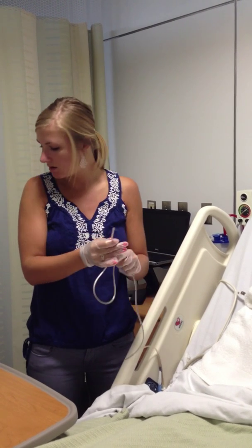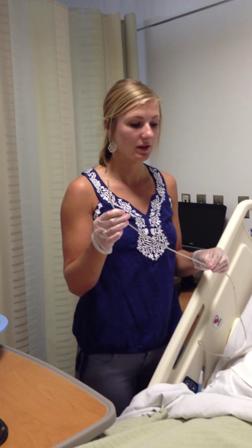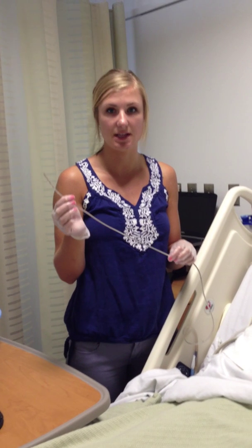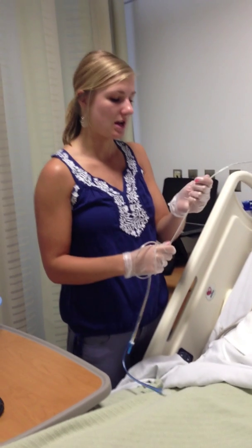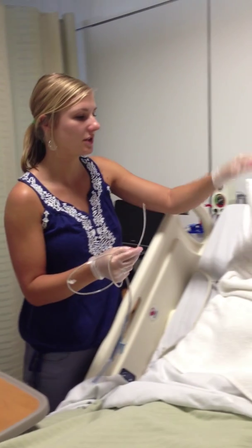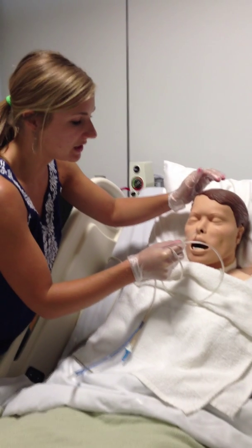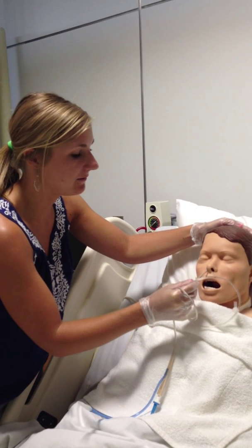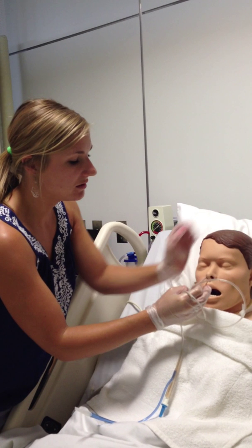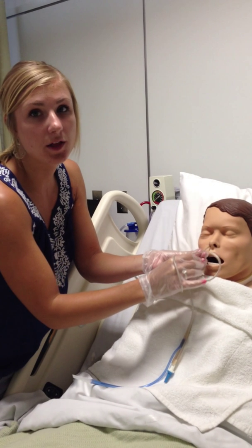I'm going to give our patient a cup of water, which will help during insertion. I'd also lubricate four to five inches of the tip of the tubing to help the process go in a little bit smoother. To start, I'm going to have the patient tilt their head back as we insert the tubing into their nasopharynx, pointing it towards the ear. Once it's in the nasopharynx, they're going to tilt their head forward and swallow as the tube goes down — this is where the water can be useful to help them swallow.